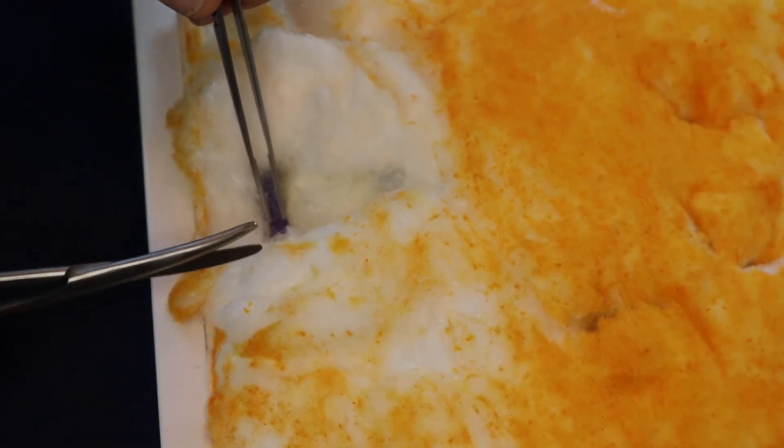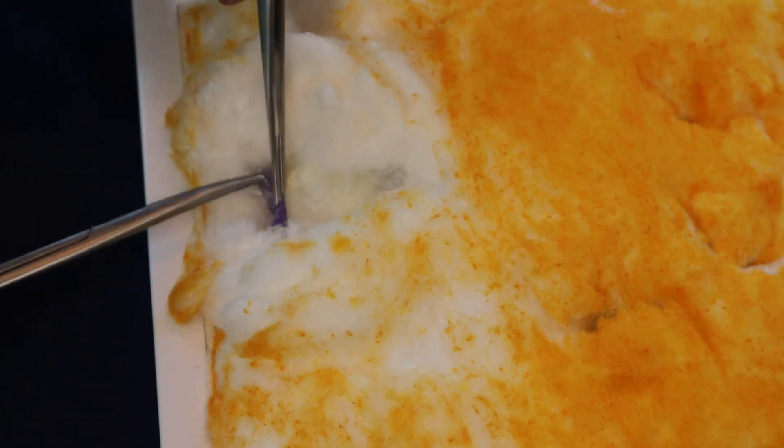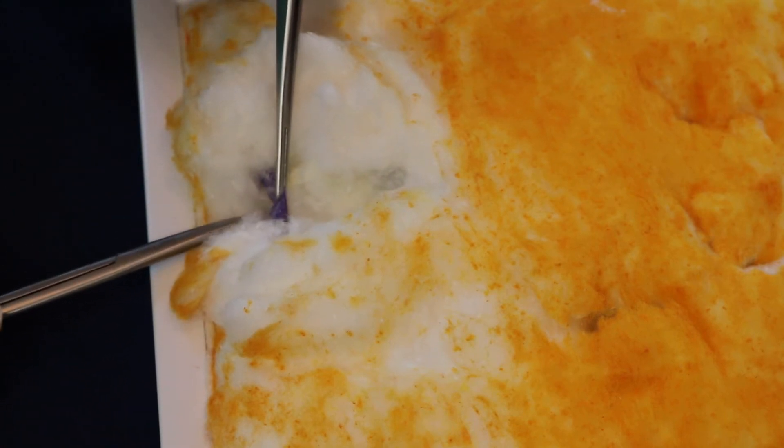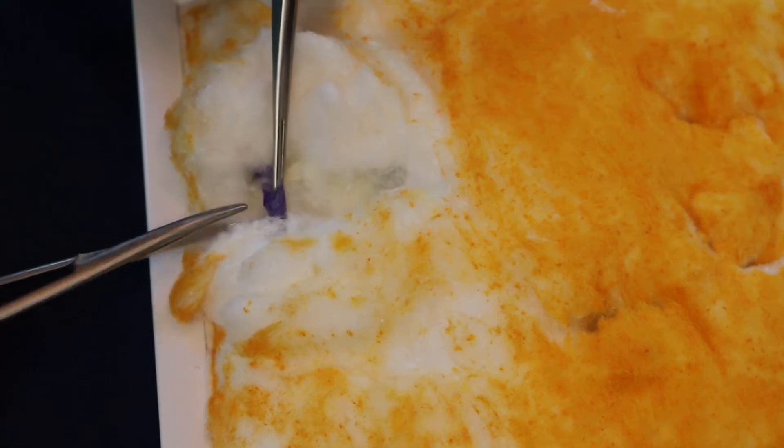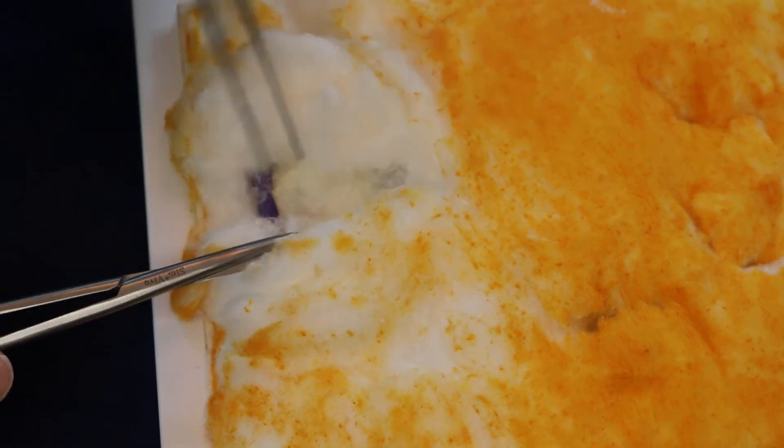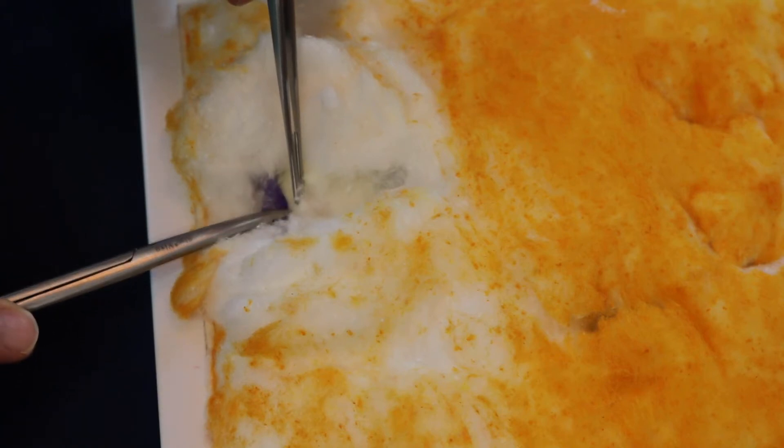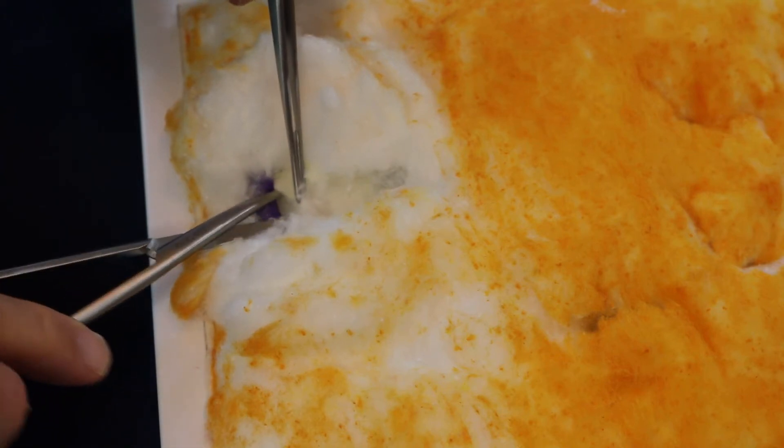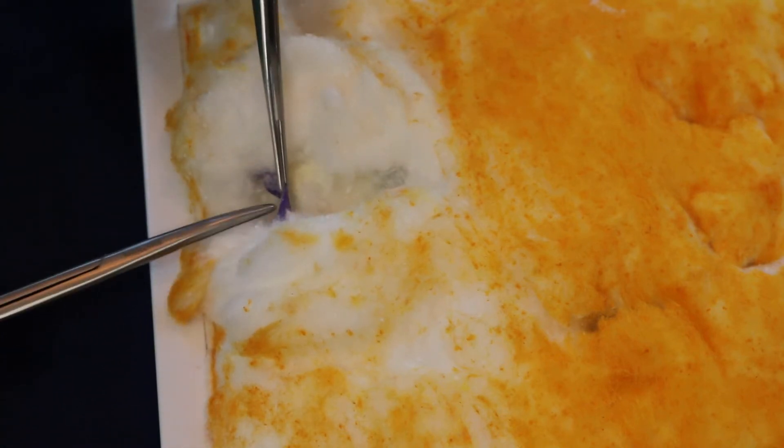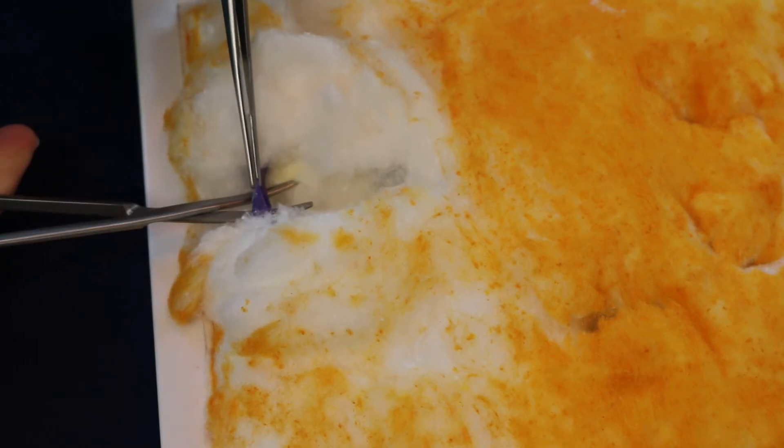Removal of the vein will require incising the fatty tissue over the entire length that is to be removed. This can be done in steps. Once the simulated vein has been identified, dissection should continue over the anterior surface for a period of several centimeters. The vein can then be retracted by gently grasping the surface and retracting it superiorly while the undersurface is dissected away from the surrounding tissue.